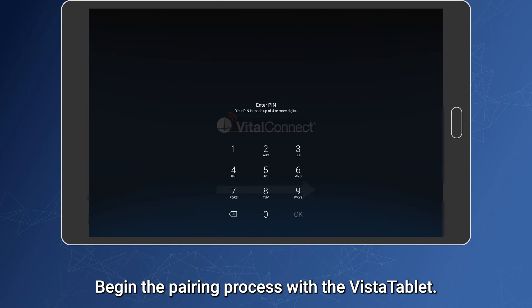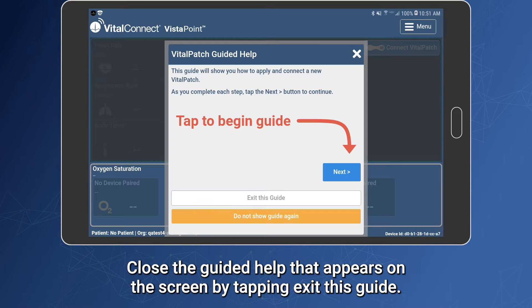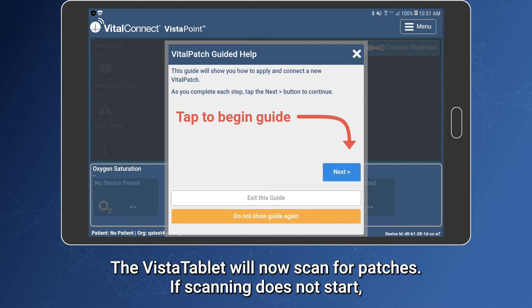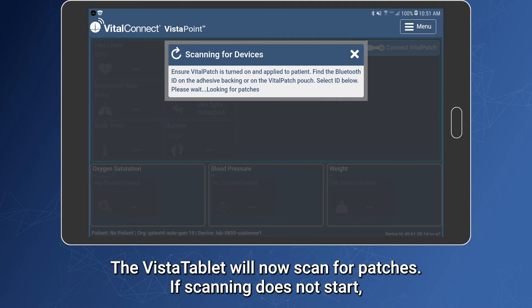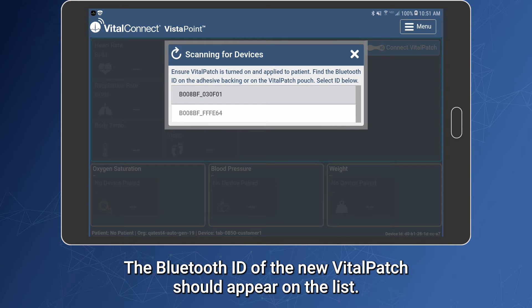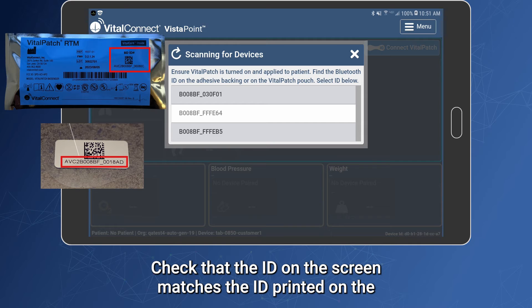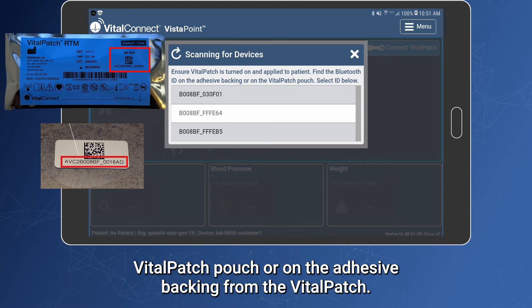Begin the pairing process with the Vista tablet. Unlock the Vista tablet and close the guided help that appears on the screen by tapping Exit this guide. The Vista tablet will now scan for patches. If scanning does not start, tap the Connect Vitalpatch button. The Bluetooth ID of the new Vitalpatch should appear on the list. Check that the ID on the screen matches the ID printed on the Vitalpatch pouch or on the adhesive backing.